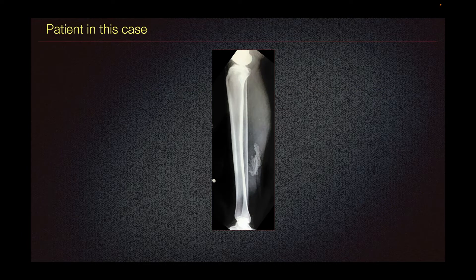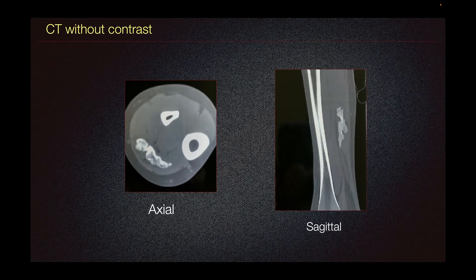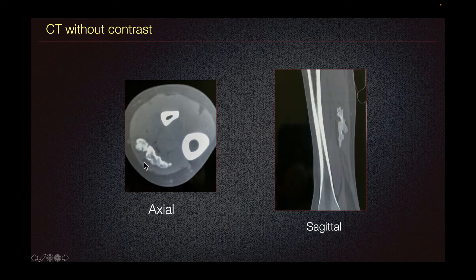The patient presented with this lateral radiograph of tibia and fibula showing dense calcification along the posterior calf. The CT demonstrates the calcification correlating to the finding on radiograph, demonstrating this curvilinear calcification in the gastrocnemius muscle.